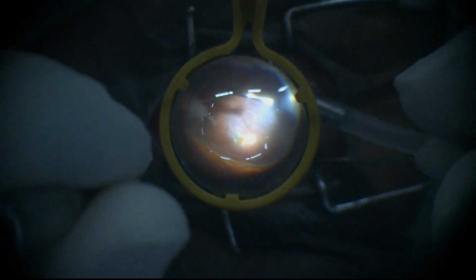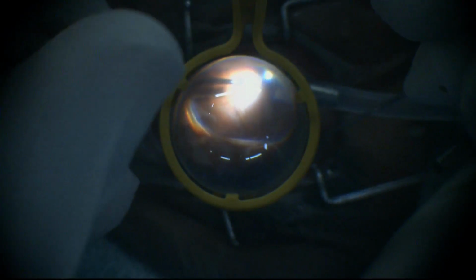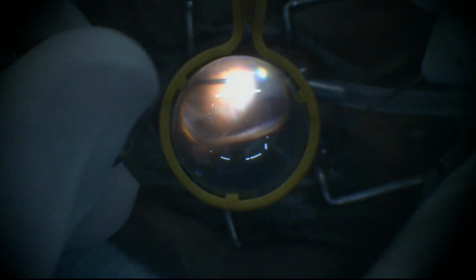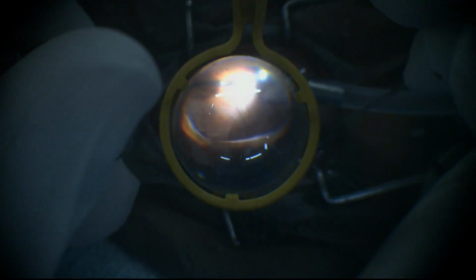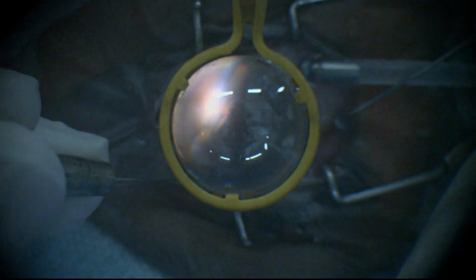Have you ever wondered that once we remove the vitreous, shouldn't the eyeball collapse? Yes, sir. I've always wondered that, but then why doesn't it collapse? We replaced it with oil or C3F8 immediately. Why does it not collapse?